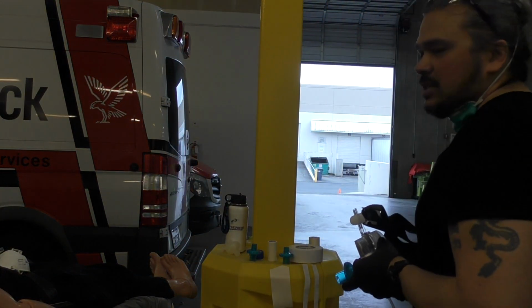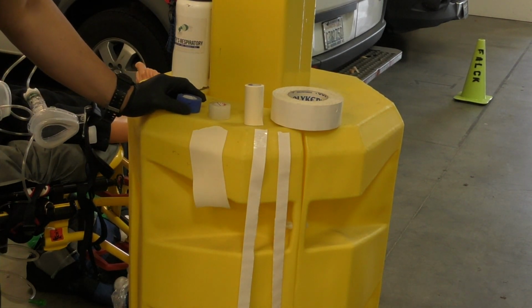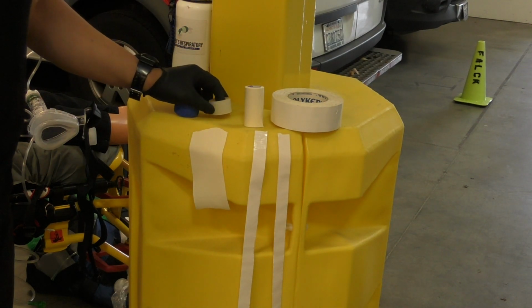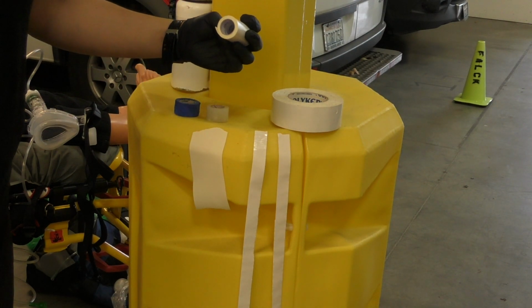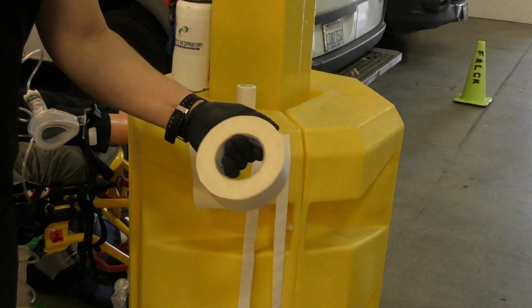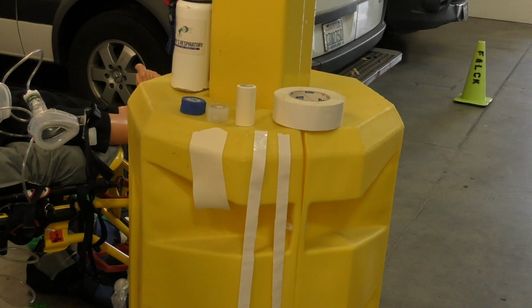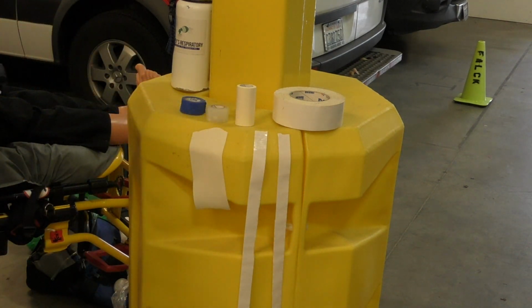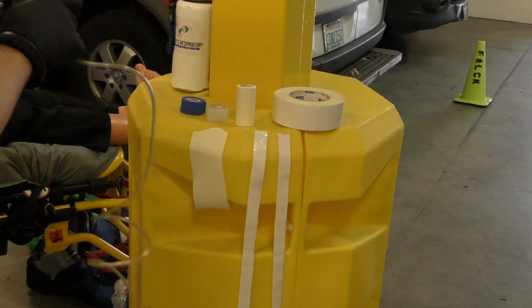So I'm going to use a couple things that you have on your rig. Here we have four types of tape that are commonly on your ambulance and your rig. We have Coban, we have this regular transparent tape, we have this microfoam tape, and also good old duct tape, okay? If you have any of these, you could modify this, because what we're doing again is we're just trying to make this filter fit. I pre-arranged some of this stuff.